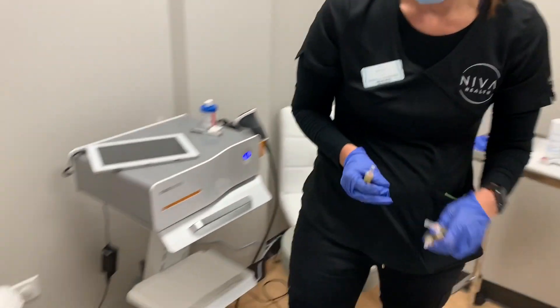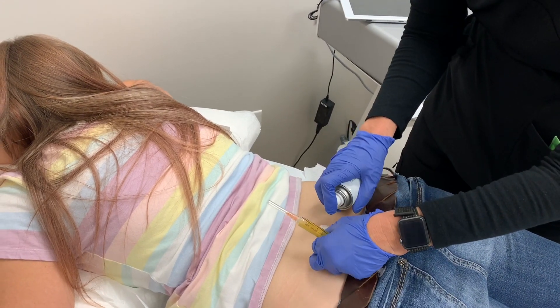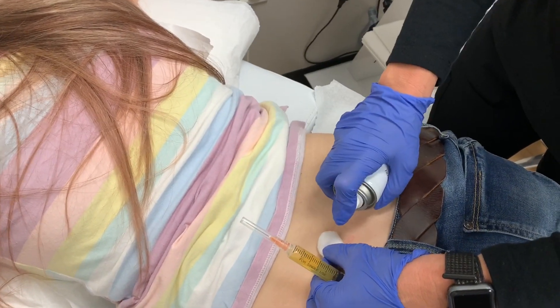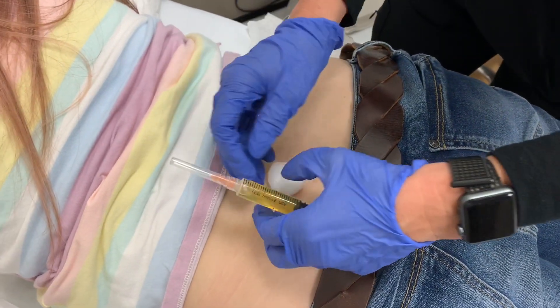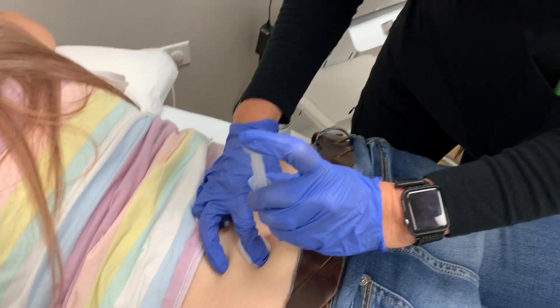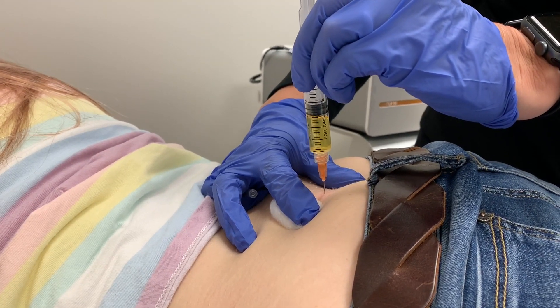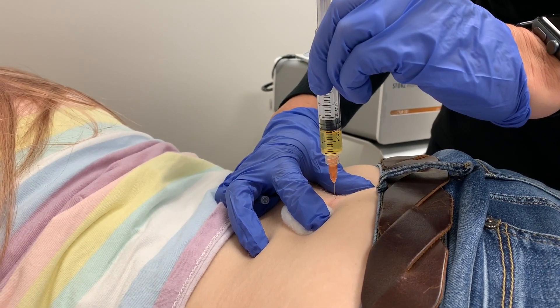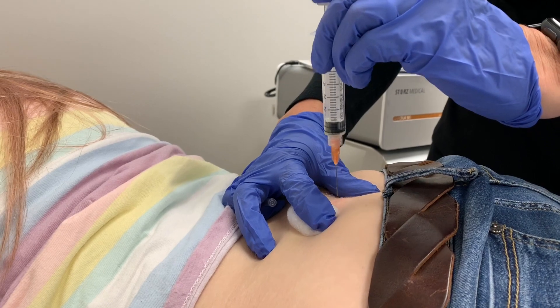Now we are getting ready to inject the PRP in her SI joint — she's marked. A little numbing agent. When I had my shoulder done, that hurt more than the needle. Feel the pinching? It's like pins and needles. Might feel some pressure. Doing okay? Mm-hmm.